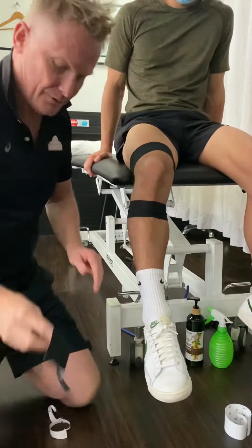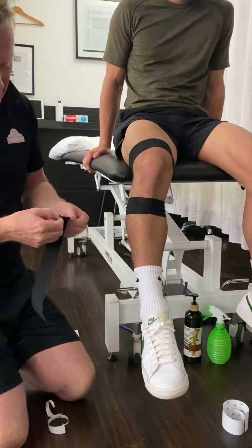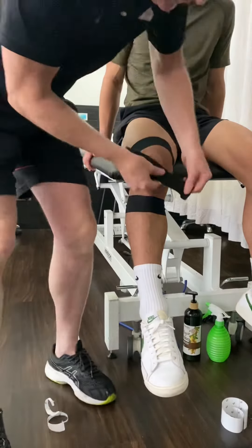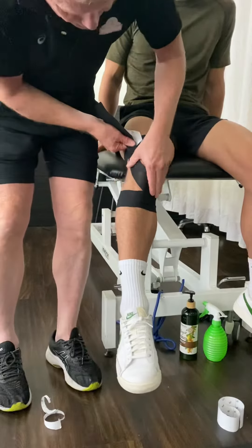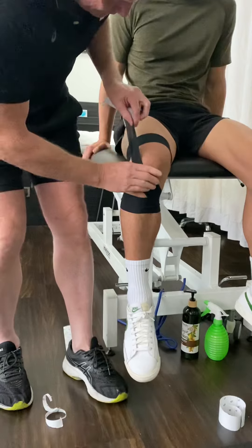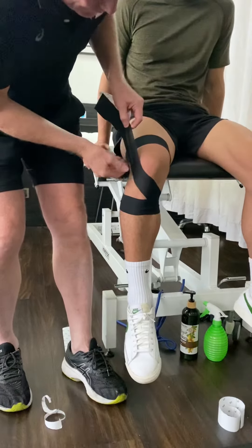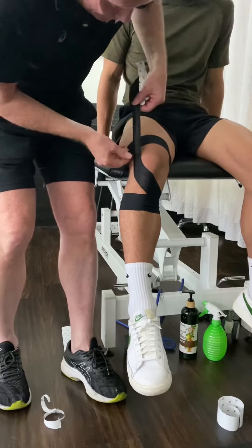We then use one piece of tape. We're going to start around here, fairly firmly — just relax your knee there. And you might just straighten it a little bit more, yeah cool. And I tend to wrap it around the top.